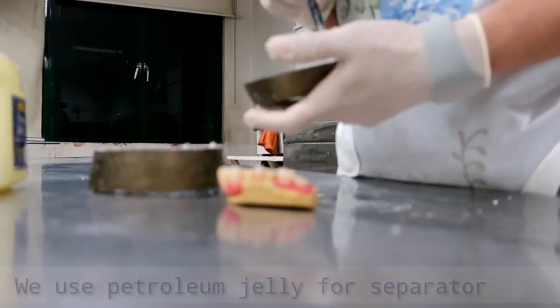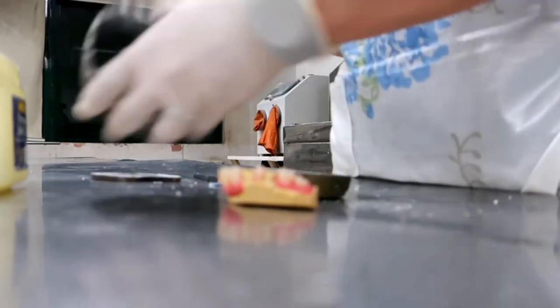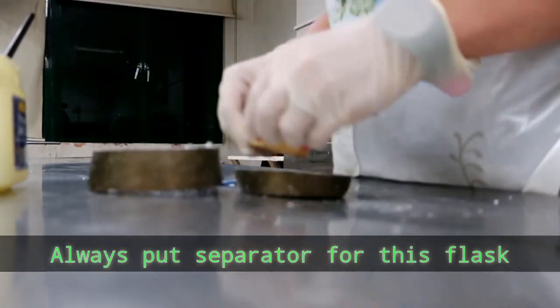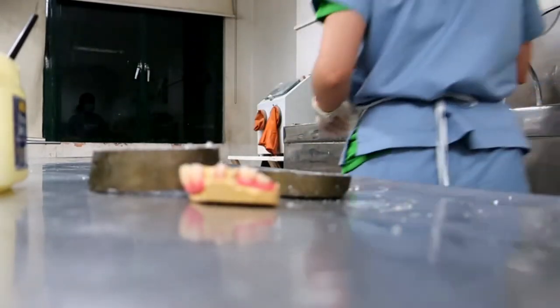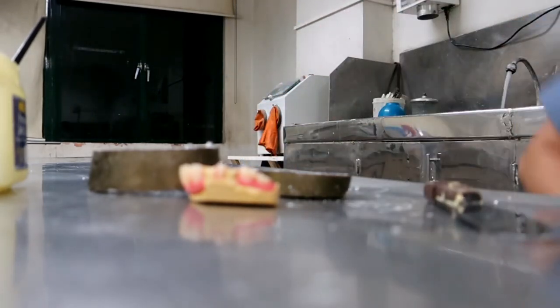Now I am going to start investing the RPD denture. Make sure you put thick separator on your flask so that later when you divest it, it will not be hard for you to remove it from the flask.